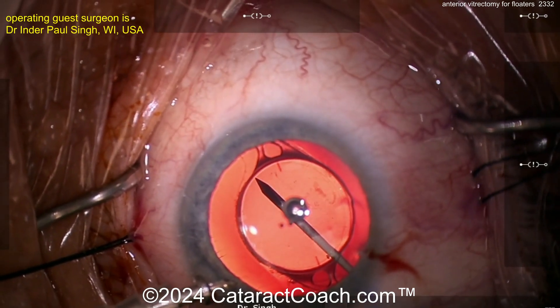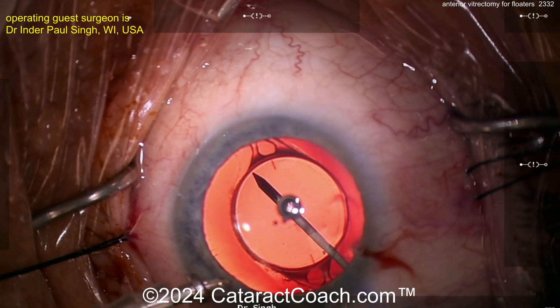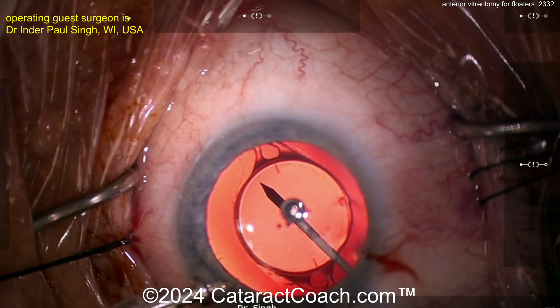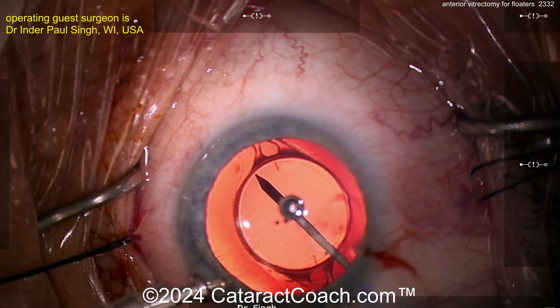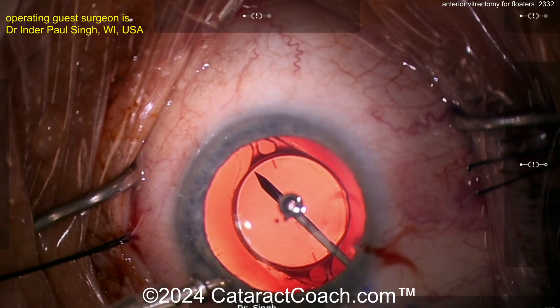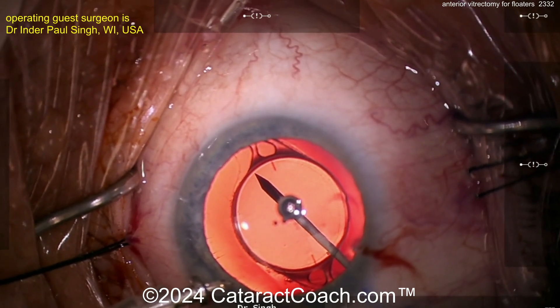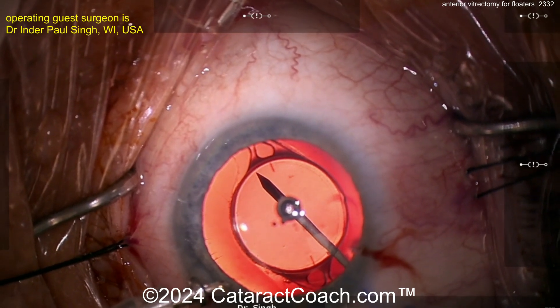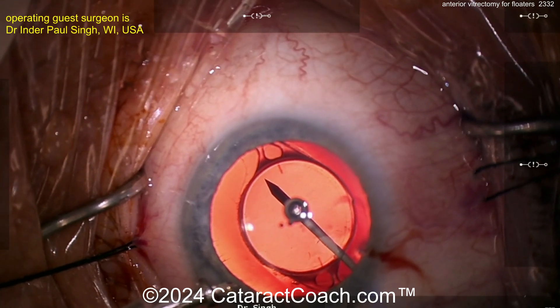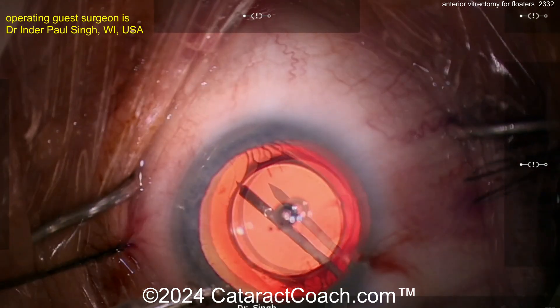You can see how nicely those particles and opacities come towards the tip. I start really behind the lens and slowly march posteriorly, but again not sweeping, not moving, keeping as steady as possible, letting it cut first. This puts less traction onto the vitreous and onto the retina from the peripheral vitreous. I'm going a little deeper now, staying there for about 30 seconds, trying to keep with minimal movement, not pulling on any vitreous as much as possible.